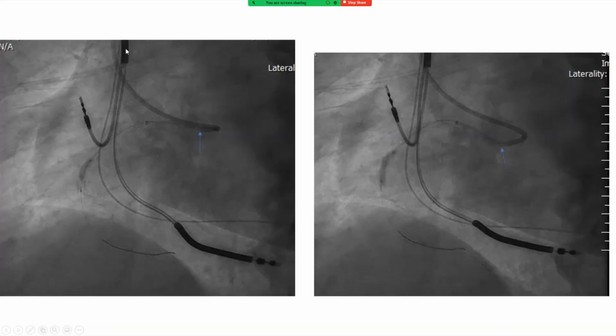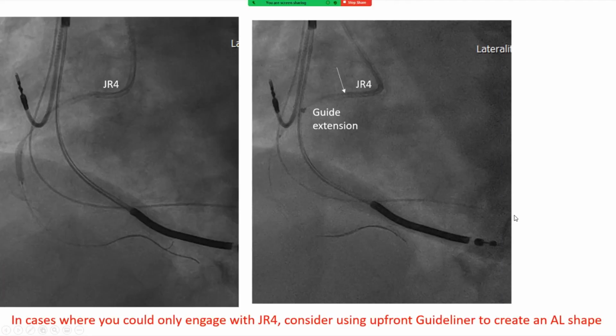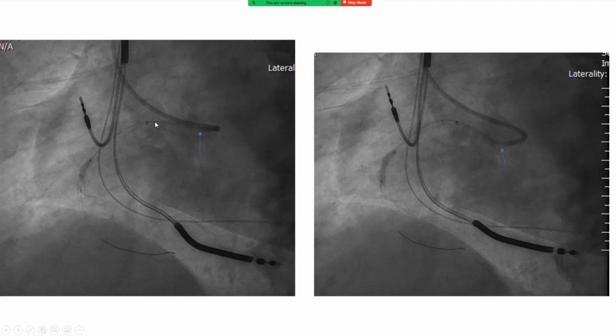This is an illustration here of how we create an Amplatz left shape using a GuideLiner. So this is a JR4, the tip of it here, and this is the GuideLiner. It finishes here, and this is an Amplatz left shape created with the GuideLiner. This is another way. This is a JR4, finishes here, and this is the guide extension, finishing here, and an Amplatz left shape. Consider using, in those cases, the Guidezilla 40 centimeter instead of 25 centimeter to provide more stability and to allow you to get out of the guiding catheter with some distance without losing support and stability.